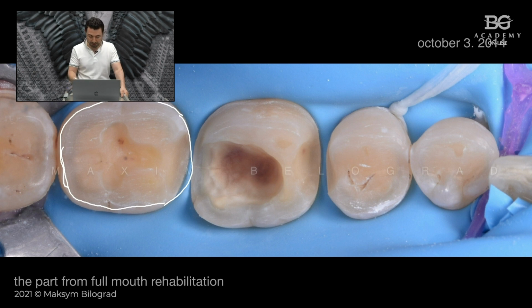First molar: considering the fact that the walls were pretty thin after old restoration removal and caries removal, we had to cover the cusps just to reinforce them, but also in such a case we redesign occlusion. That's why we need to cover the whole occlusal surface for a full mouth rehabilitation case.